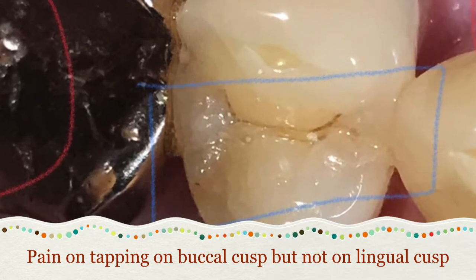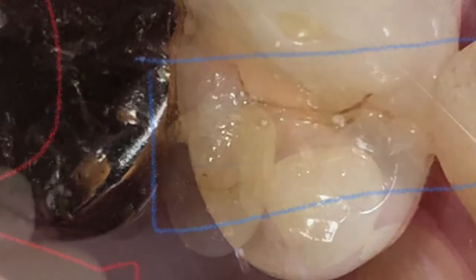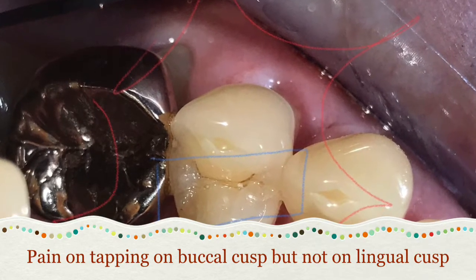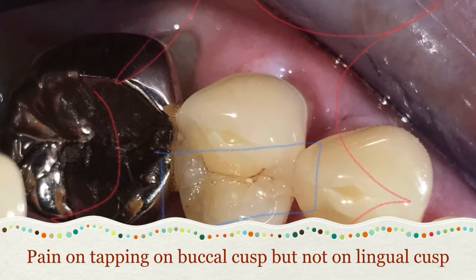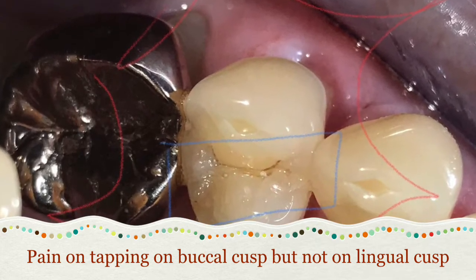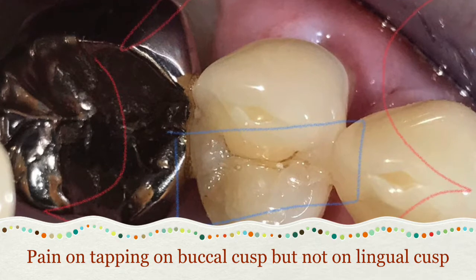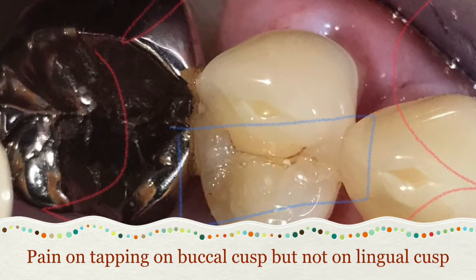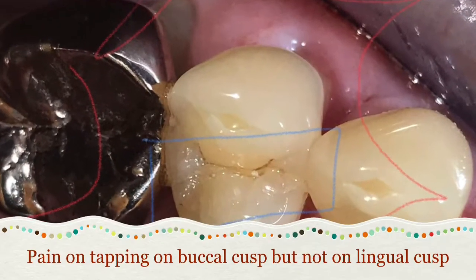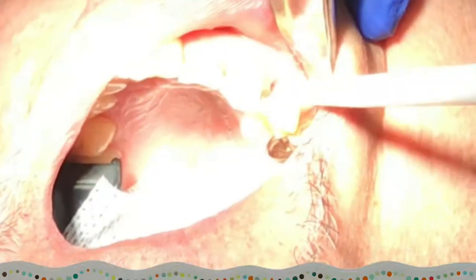The way to determine whether this tooth is hopeless or saveable is to first do periodontal probing around it. In this case, on the buccal side there's a deep pocket — more than five millimeters — but on the lingual side it seemed very normal. That's one suspicious finding. The other test I did was tapping the tooth: the patient felt more pain on the buccal cusp than the lingual cusp, indicating the buccal cusp is fractured and the lingual cusp is not.